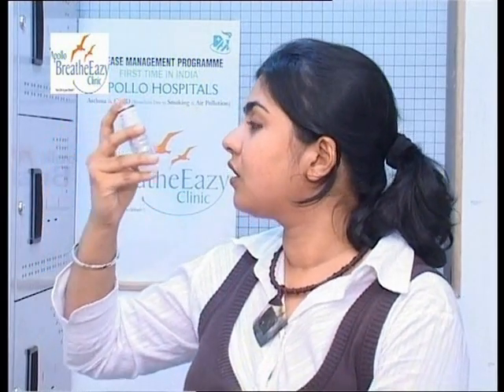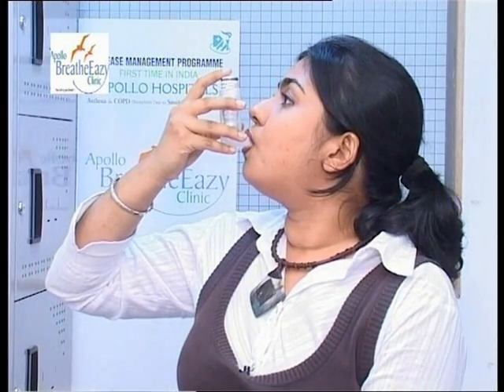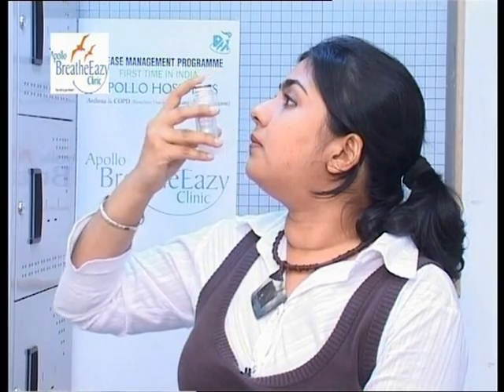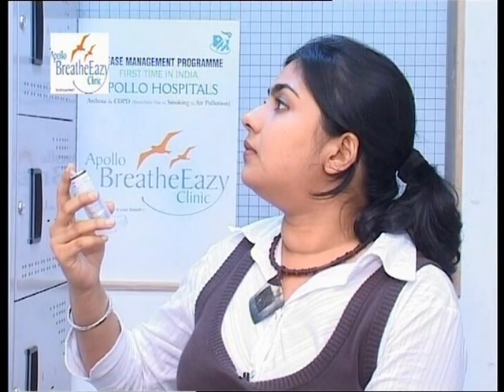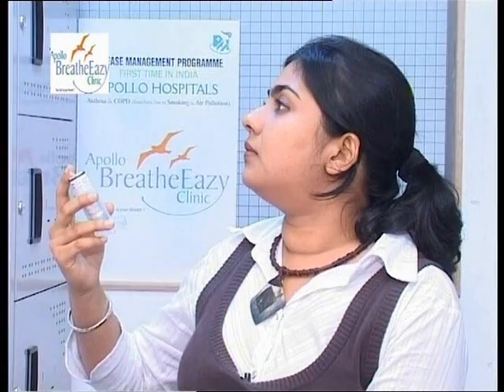This is an inhaler. Shake the inhaler, put it to your mouth, and spray. Breathe deeply, hold your breath for 10 seconds, then exhale.